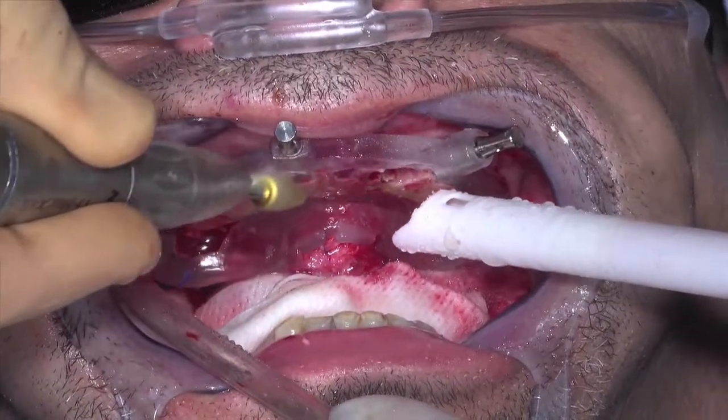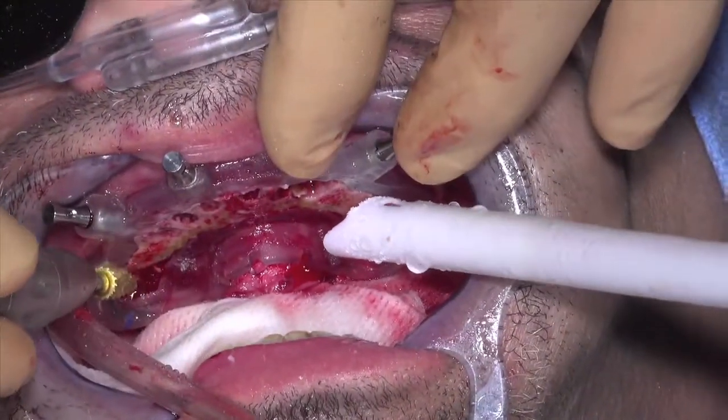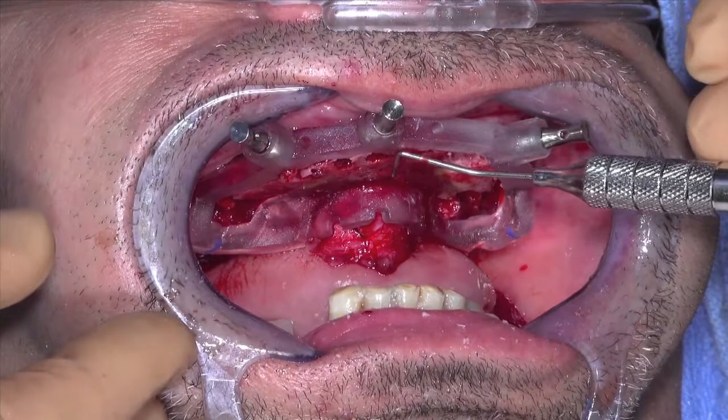The end goal is to have the entire alveolar ridge flat and flush to the bone foundation guide. Too much bone reduction would leave the implants above the crest of the alveolar ridge. Check the reduction with a metal periodontal probe.